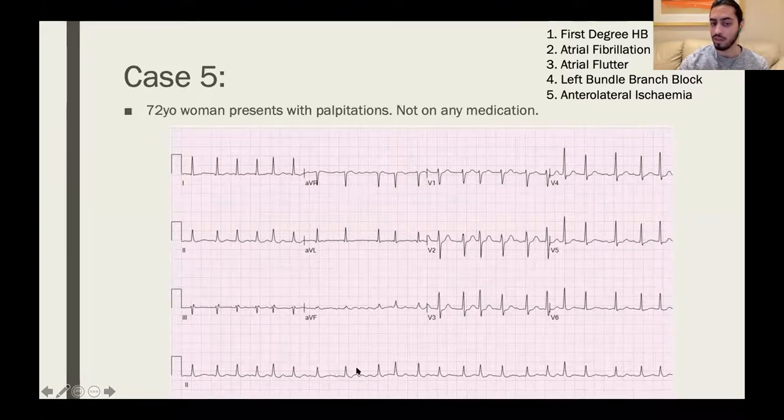If you look at this one, very wide, very narrow in the middle. So it's variable rhythm. Is it sinus rhythm, however? Well, not really seeing any P waves. And I know there's always some confusion about, I think someone mentioned earlier, how you can tell if it's a P wave versus a T wave.